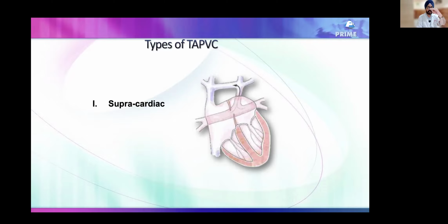So a part of the left atrium, which is of the left atrial appendage, lying on the distal part, that part of the left atrium is true left atrium. Rest of what you see as left atrium is the common venous chamber which has been absorbed into the left atrium.